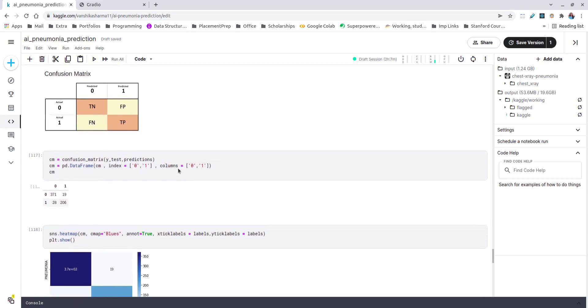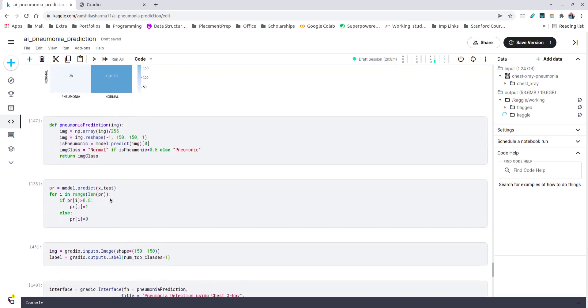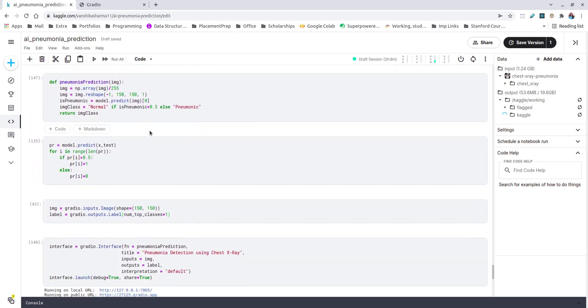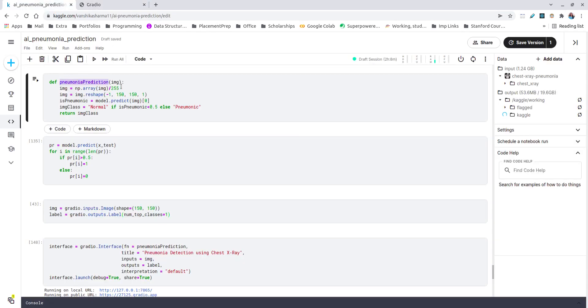Then the confusion matrix, which is a standard evaluation matrix for binary classification, categorizes my false positives, which are pretty low at 19, and false negatives is 28 out of, I guess, 650 to 670 validation or testing dataset. Then this particular function is used to predict one particular image, which in my UI I take it as input and give this to my function pneumonia_prediction and returns a static class—normal or pneumonic—according to if it is less than 0.5 I'll tell it as normal, and if it is greater than 0.5 I'll tell it as pneumonic.